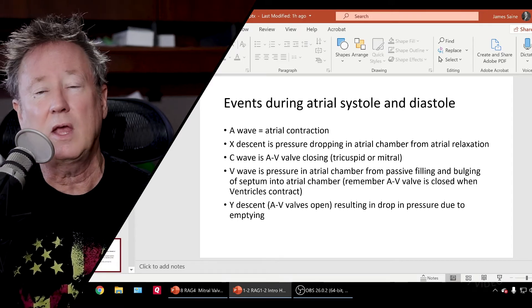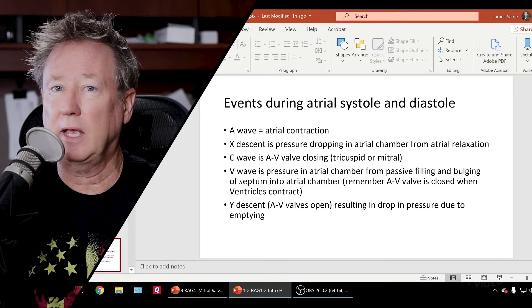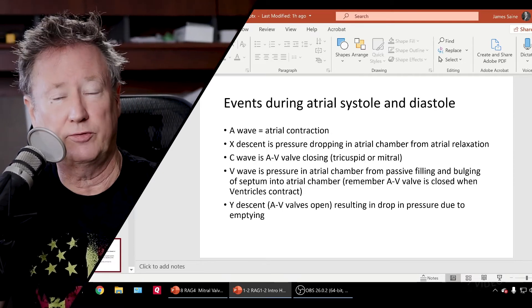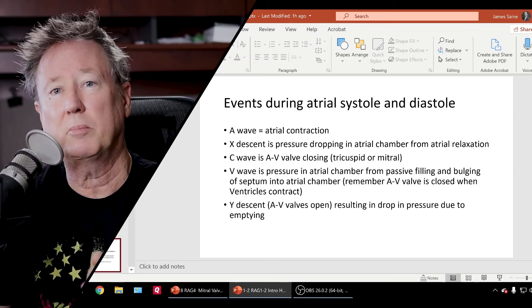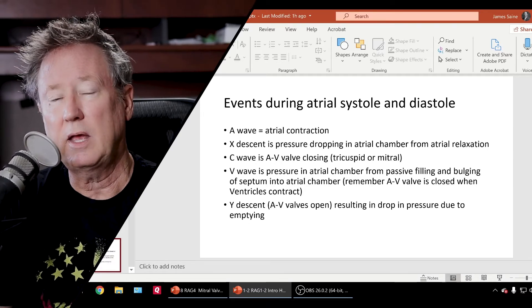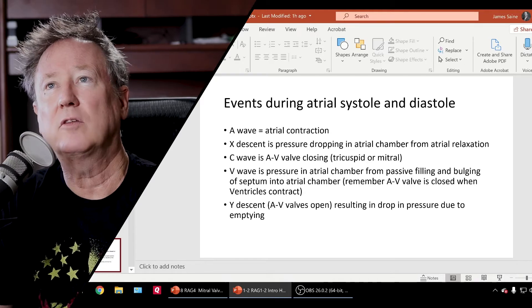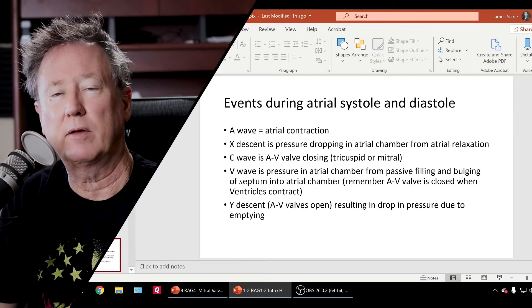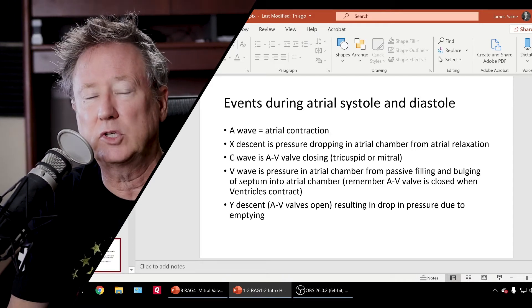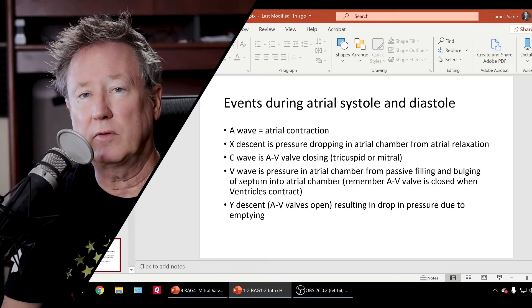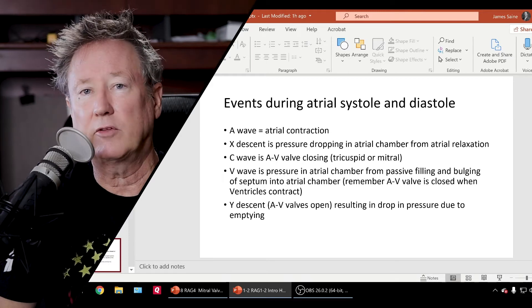The X2 descent continues as pressure drops because blood has left the atrium. The V wave represents atrial filling. During atrial filling the pressure starts coming up, but the ventricles are contracting and emptying out their blood as the atria is filling. The septum bulges into the atrium with the contraction of the right and left ventricle, adding to the pressure of the V wave. When you either reach the peak of the V wave or the very beginning of the Y descent, that's when the atrial ventricular valves open — the mitral valve on the left side. Then during the Y descent, as blood is being ejected out, the pressure drops because blood is leaving the chamber.